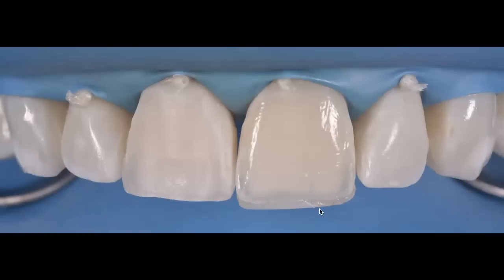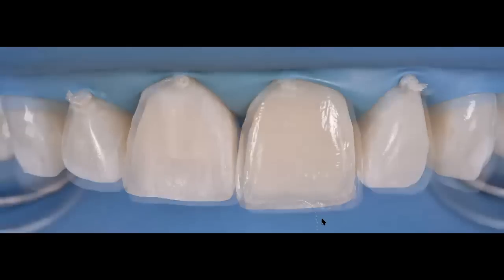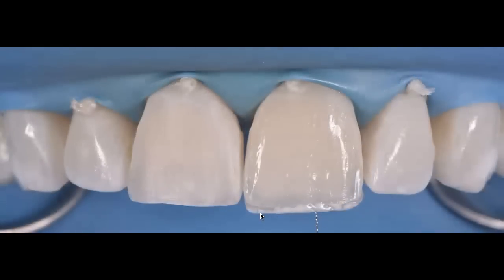And what I did here first was I needed to add some length to the teeth. The patient was unhappy with the actual length of 8 and 9. They were just too close to the length of 7 and 10. So we decided to add half of a millimeter more of length to 8 and 9. So I'm adding a little bit of enamel on the lingual aspect of this tooth number 9. And once I do that, I'm going to add a little bit of the white opaque because the patient had a white halo effect on the inside.